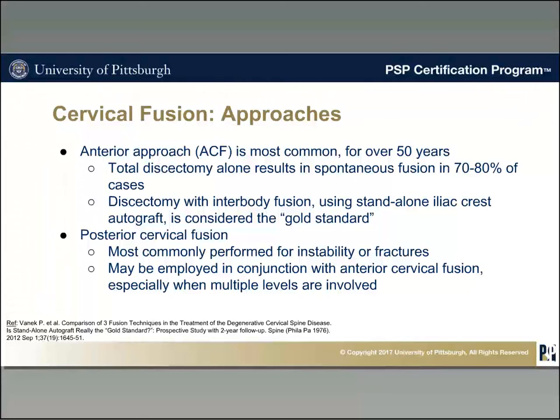The posterior cervical fusion is performed usually for instability or fractures. It may be employed in conjunction with anterior cervical fusion when multiple levels are involved.